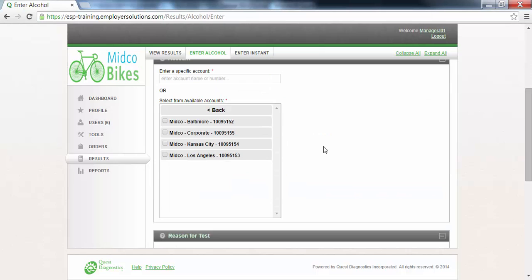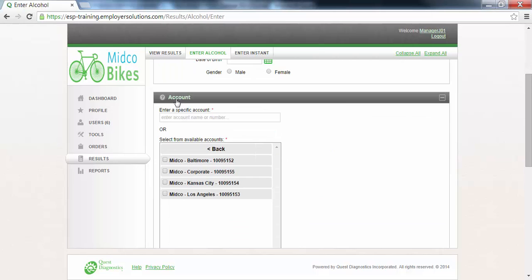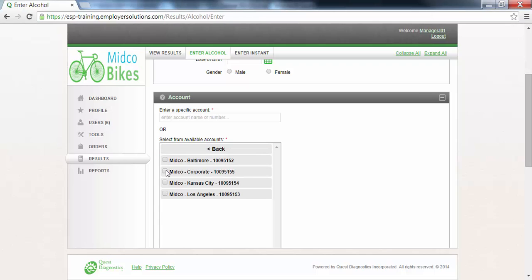The account section will display a list of all of the Quest Diagnostics accounts available to you. Only one account may be selected. Select the check box next to an account in the available accounts list. In this example we will select the account for the corporate location.